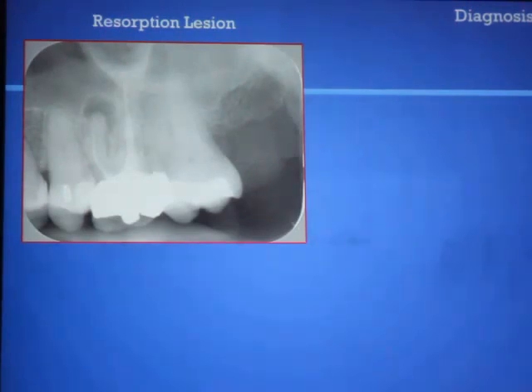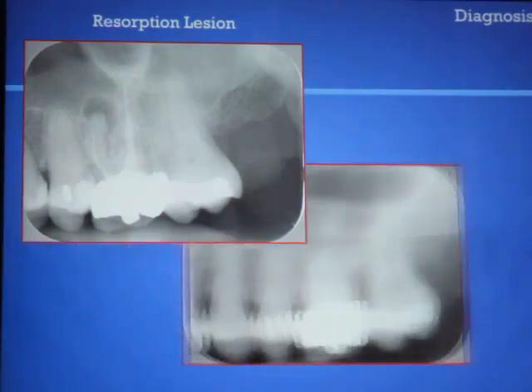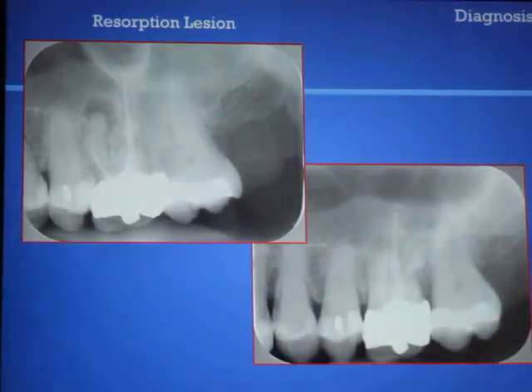As a standard procedure for the retreatment, you take 2 radiographs from a different angle, and I took another radiograph from a different angle, and I noticed that the distobuccal root doesn't look very intact here.